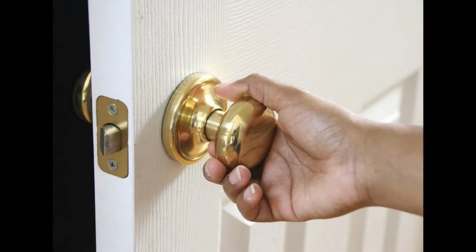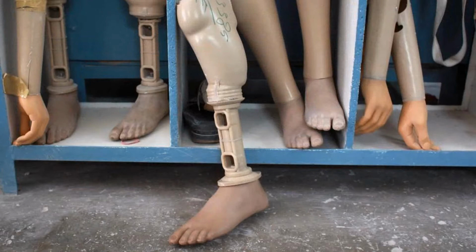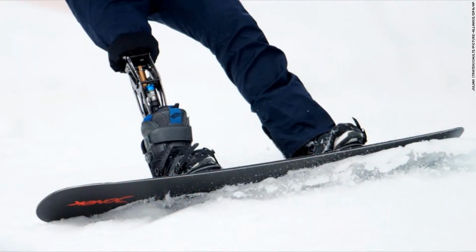As humans, limb usage is integrated into almost everything we do. While they cannot match natural limbs, prosthetic limbs are imperative for amputees to continue to function within society. Today, amputees can choose their prosthesis based on preference. Some may choose natural-looking cosmetic devices that lack functionality. These are known as passive prosthesis. Others may choose body-powered, functional devices at the cost of appearance. These are known as active prosthesis. Athletes may even use sports or activity-specific prosthetics.